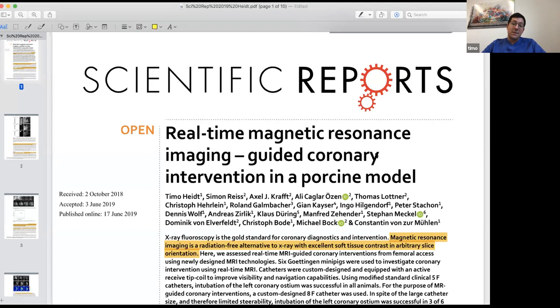One more limitation is that in recent years, the coronary vessel wall has gained importance, and coronary catheterization and contrast-based techniques so far only give you an indirect approach to your vessel wall. You fill the vessel with contrast agent, and this is basically what you see. So looking into the future, there are reasonable questions whether that's really a technique to rely on as a long-term goal, or if there are alternative techniques.